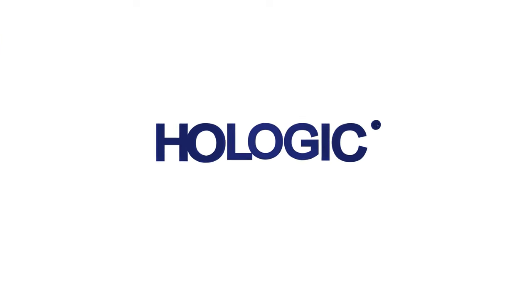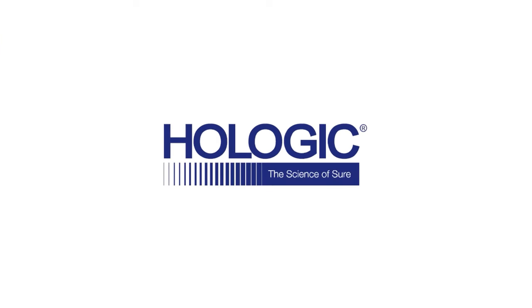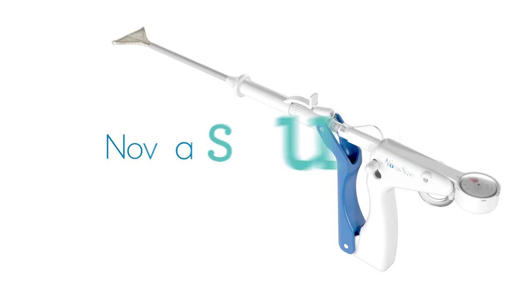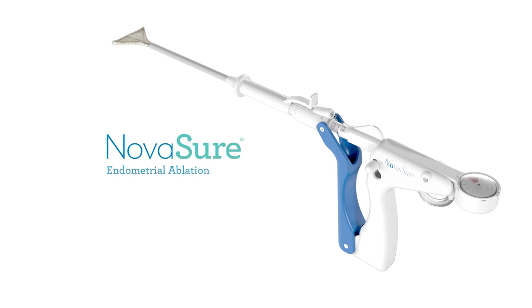This video demonstrates the seating technique for the NovaSure endometrial ablation as explained in the most recent instructions for use manual. Proper seating is important to help facilitate the best outcomes for your patients. Now let us review these steps.